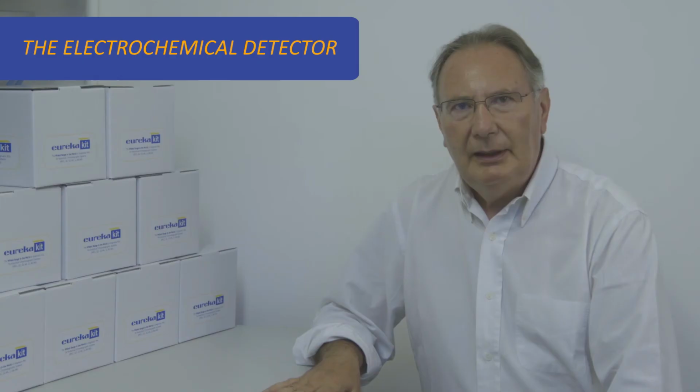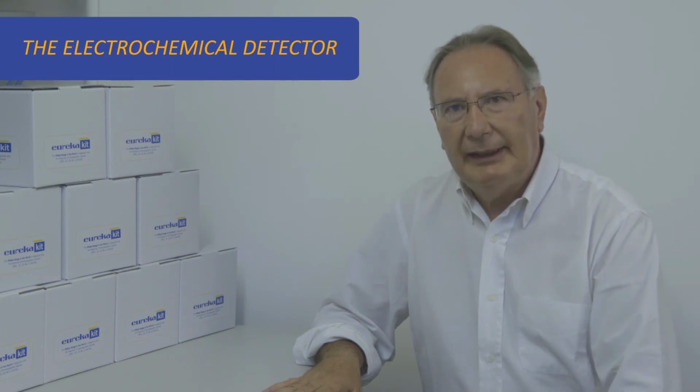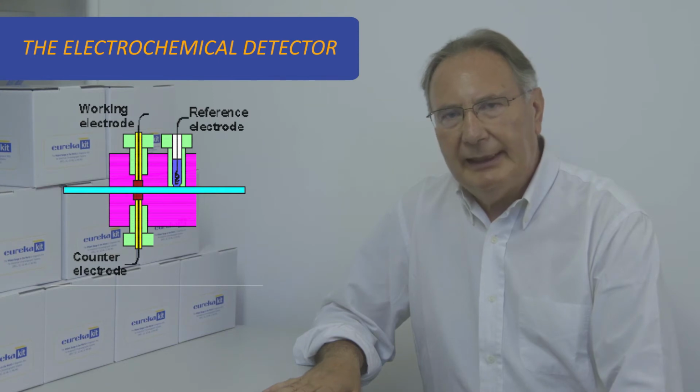I would like to briefly talk about the first two detectors, because today's objective is not to speak of the mass spectrometer. The electrochemical detector enables the direct conversion of chemical information into electric current, and it measures the current that results from applying a potential difference to the heads of the electrodes of a flow cell.